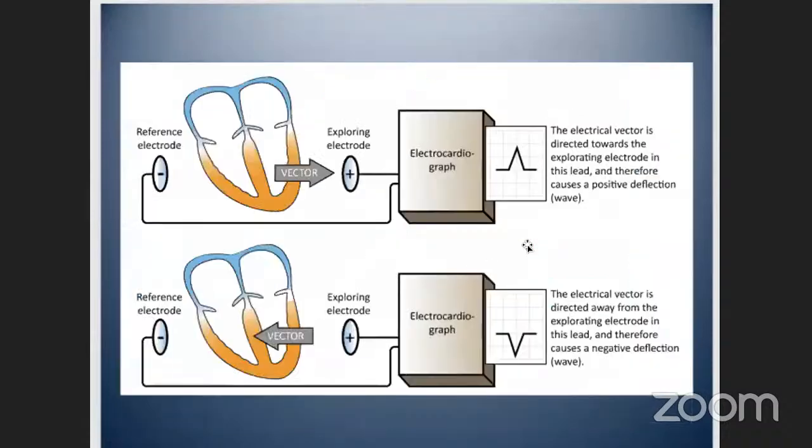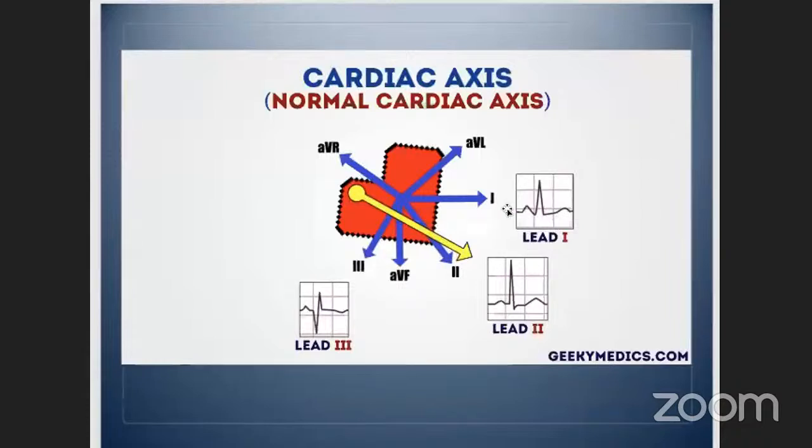And so if we return, the easiest way that we can look at this is that leads 1 and 2 should always be positive, as well as AVF. When I look at my 12 lead ECG, I will show you a picture of that later. My left hand would be my lead 1 and my right hand would be AVF. If my axis is normal, it would be positive in both lead 1 and in AVF.